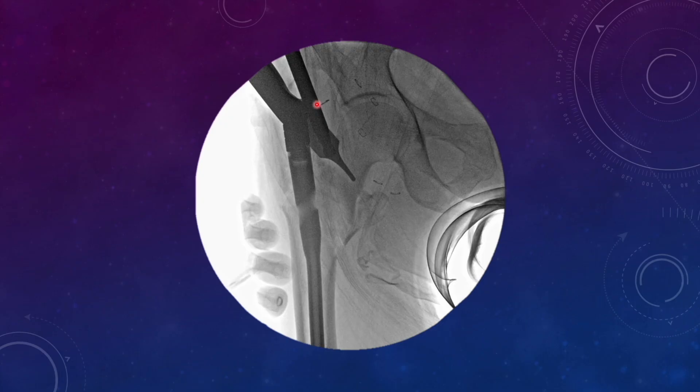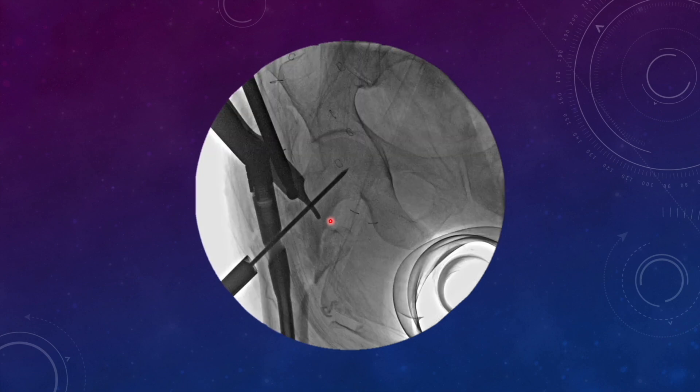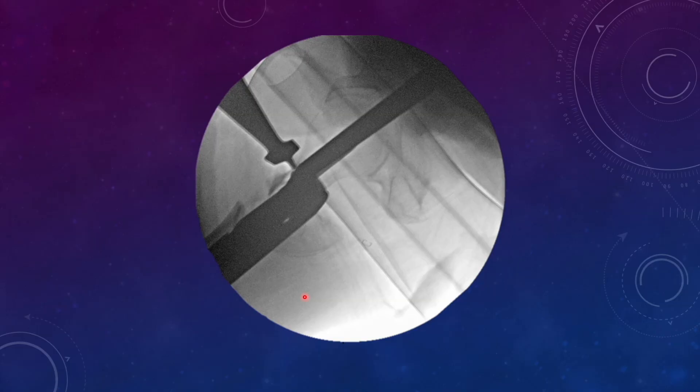The surgeon was a clever one. He tried to place a blunt instrument over the proximal fragment to valgize it. Now you see the alignment appears satisfactory and the cortex which was negative earlier has become positive. The surgeon was satisfied with the alignment, so he placed the guide wire, and throughout this procedure he was taking care of this valgization — the proximal fragment was pushed downwards so that the cortex remained positive relative to the distal cortex. In lateral view, he also ensured the guide wire remains central and the reduction is not changed.